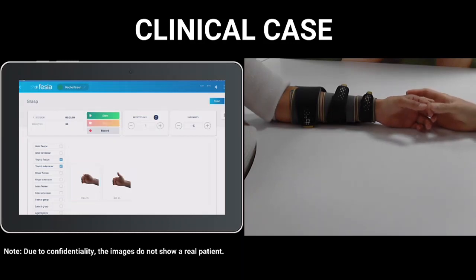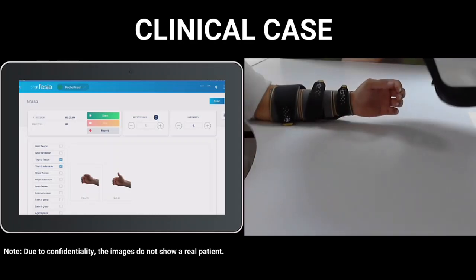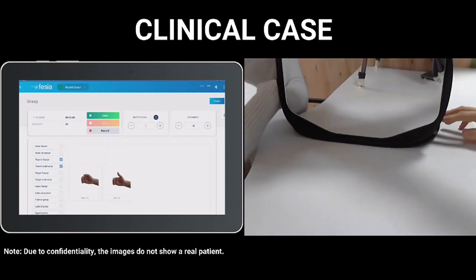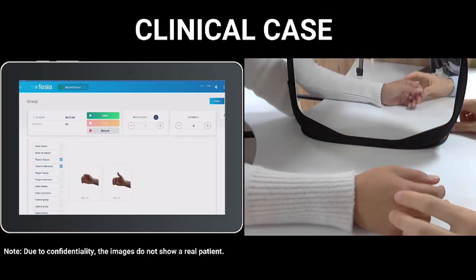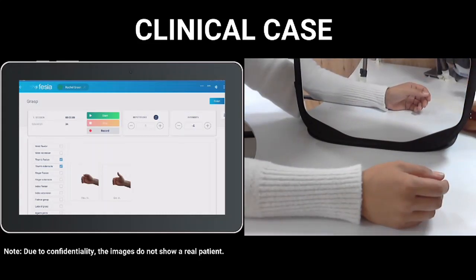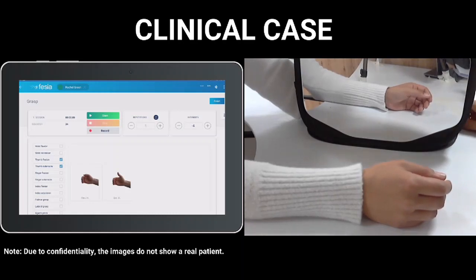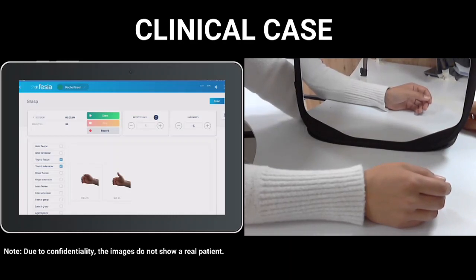Perfect. Let's stop now. The next exercise, Rachel, is going to be the same, but as I have been explaining before, we are going to combine it with the mirror therapy. Therefore, we are going to introduce Rachel's paretic arm in a mirror, and I will ask her to put her other hand in front of the mirror and to see the mirror, so that she is watching a left arm moving, but she's going to be moving the right hand.